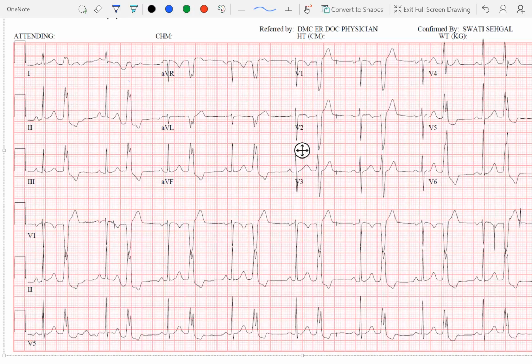Obviously, there can be PVCs coming from the septum that can have intermediate morphology. Right. But the fact that you have a left bundle branch morphology with an outflow tract morphology suggests that this is probably coming from the right ventricular outflow tract. Okay.